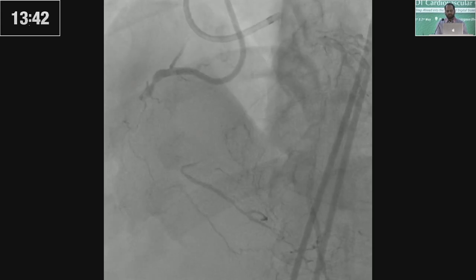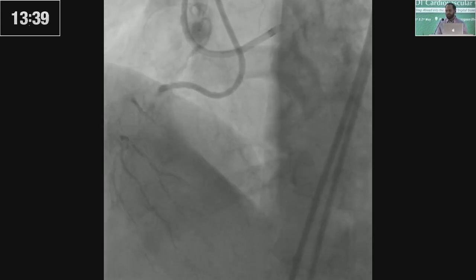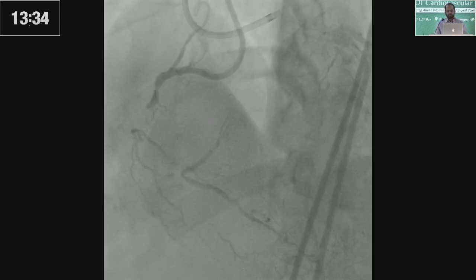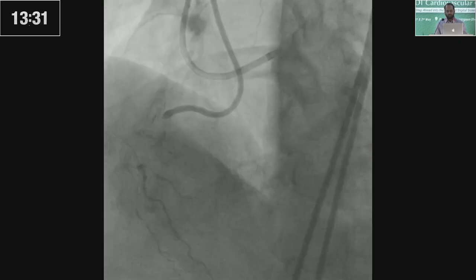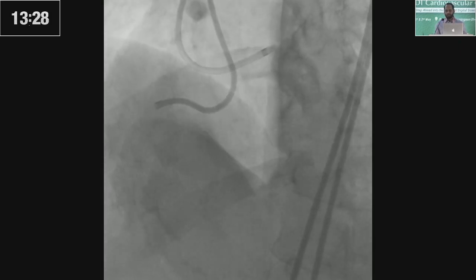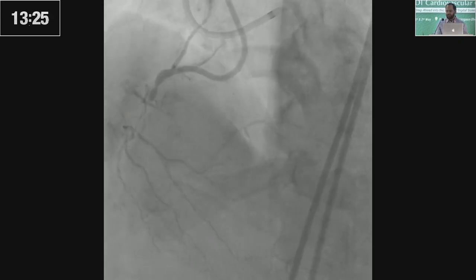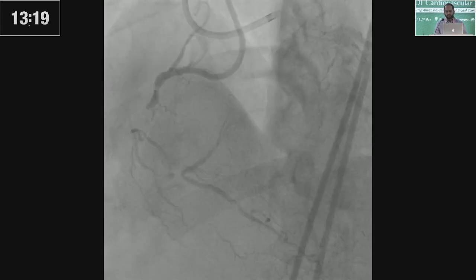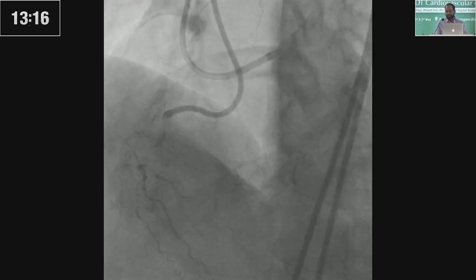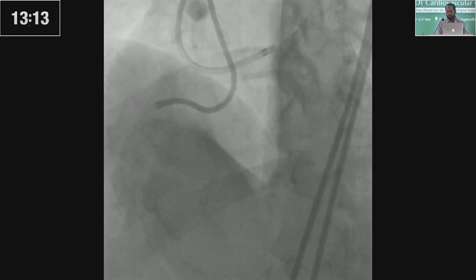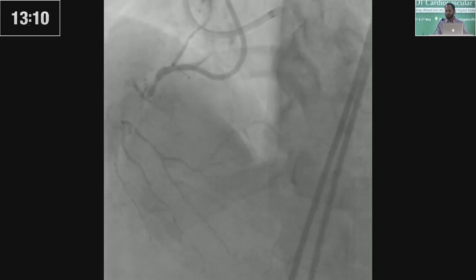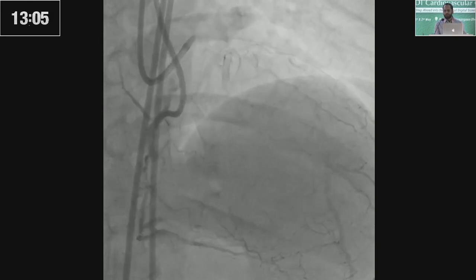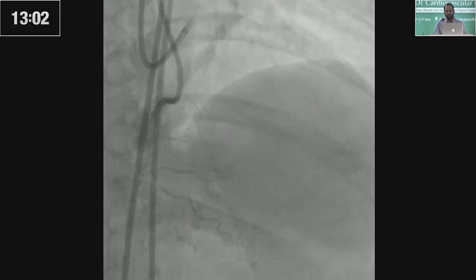This is one of my cases. The setup, as Dr. Kaiser said, we usually go with a two-axis setup and we need to visualize the distal artery. Here there's a proximal RCA CTO with an ambiguous cap. More importantly, there's a distal opacification of the distal RCA, but the distal landing zone is not too good. It's at the crux and there's disease there, which means this is not a good place where, even if you enter antegradely, getting into the distal true lumen would be difficult with the risk of losing one of the branches. You can see that there are good septal collaterals which will opacify the distal RCA, making it easier for us.